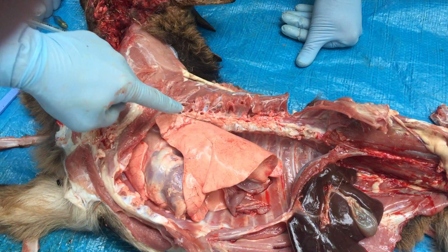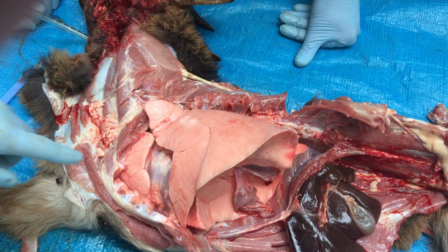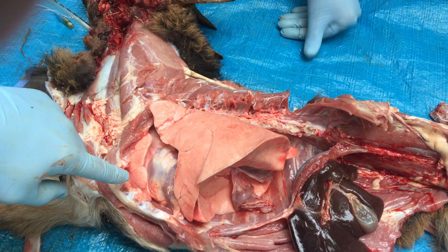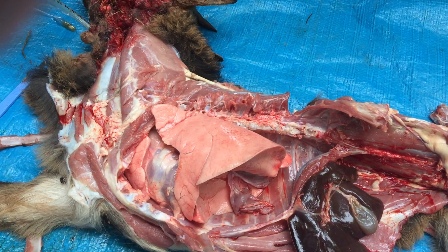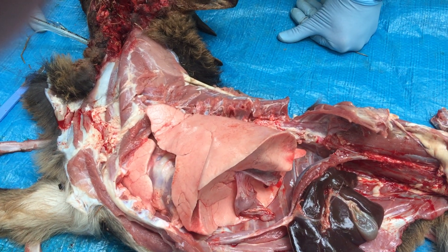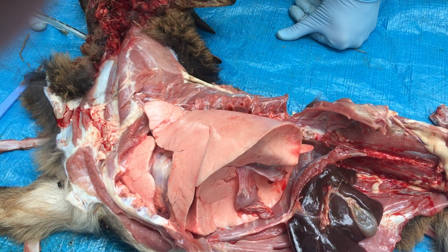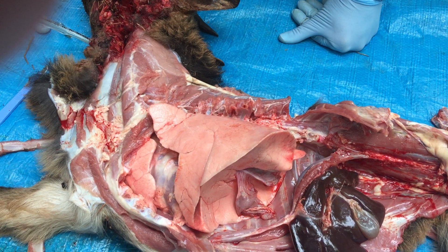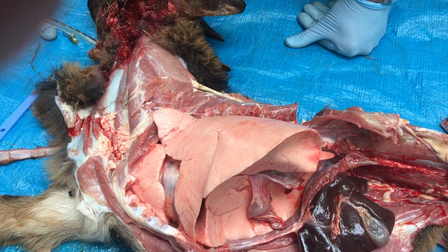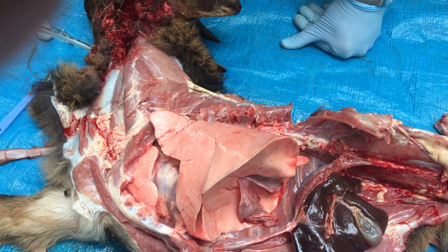It's amazing. All these bits you just can't recruit with a normal ventilator — you just can't get them. I'll put it all the way up to 20. Okay, that's on 20. Whereas now you can just — wow, look at that — open them right out. So again, this shows the benefit of PEEP for getting those other areas.